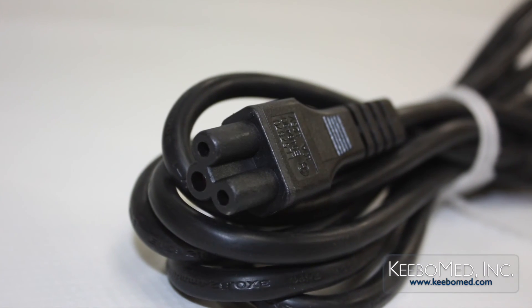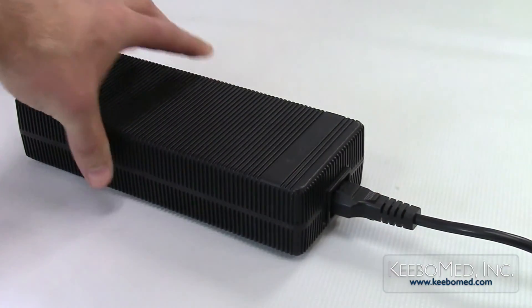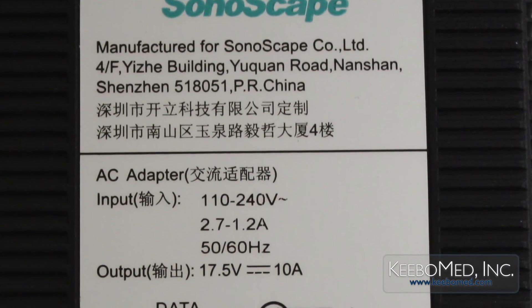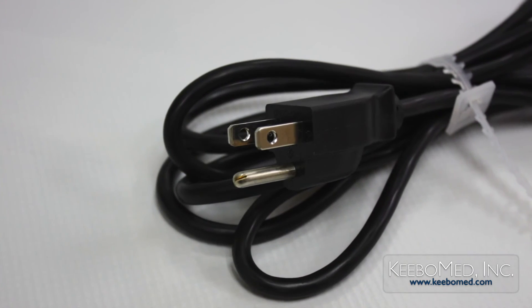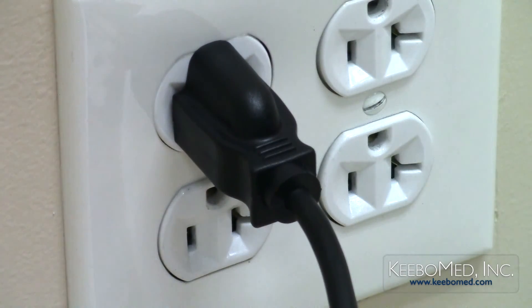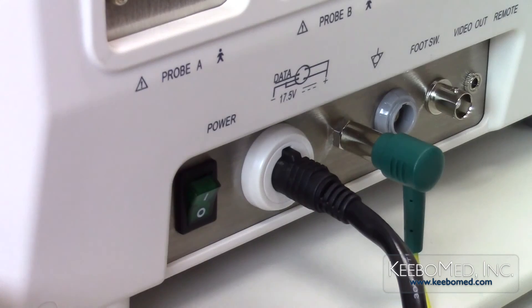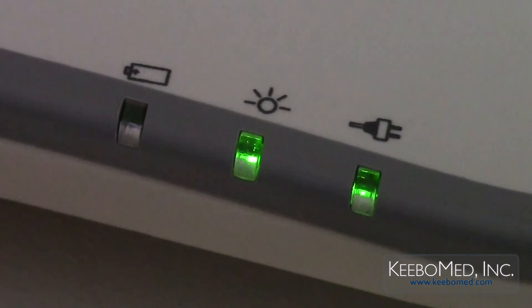Step 2: Firmly attach the AC cord to the AC power supply adapter. Step 3: Make sure that the main voltage that the system will be connected to is within the required range indicated on the system label. Step 4: Connect the power plug of the AC adapter to the power supply outlet. Step 5: Connect the DC output plug to the power supply socket on the rear of the ultrasound system. The AC power LED indicator light on the keyboard will now be illuminated.